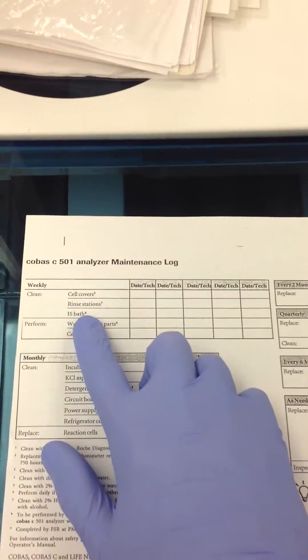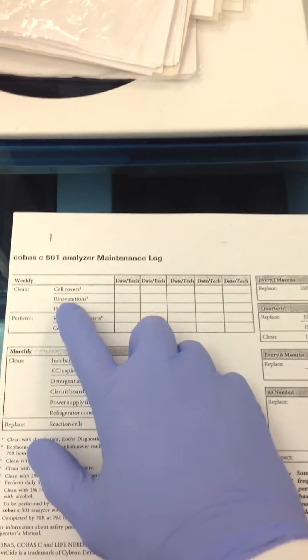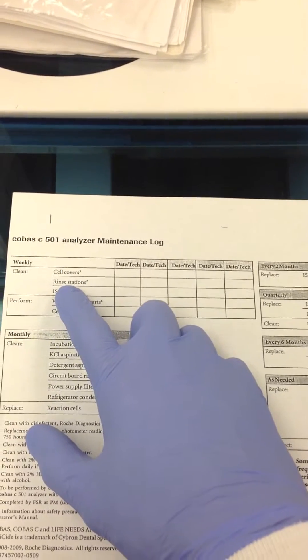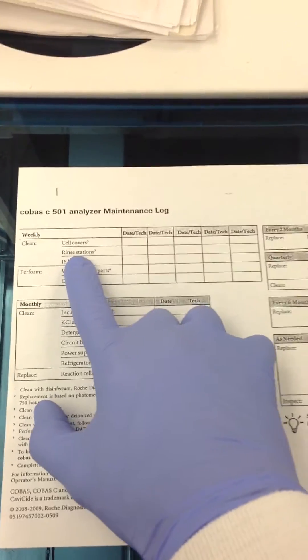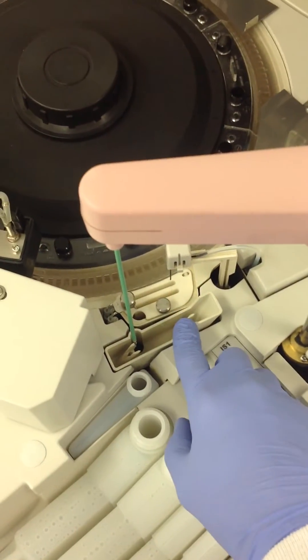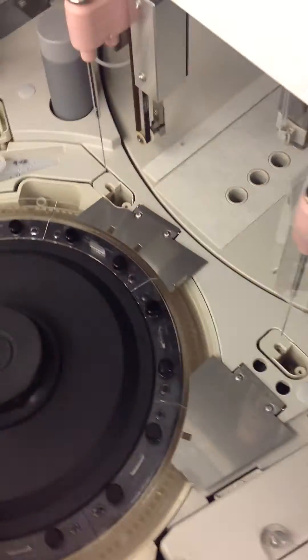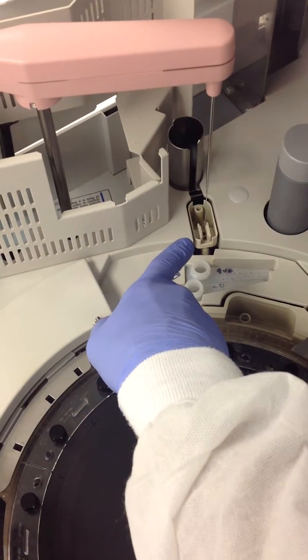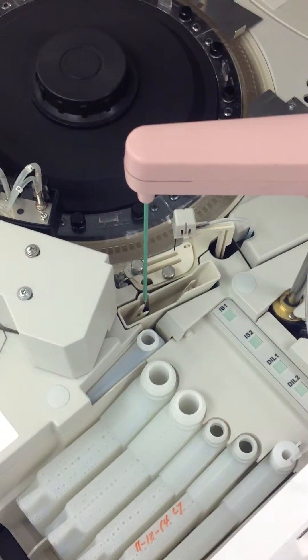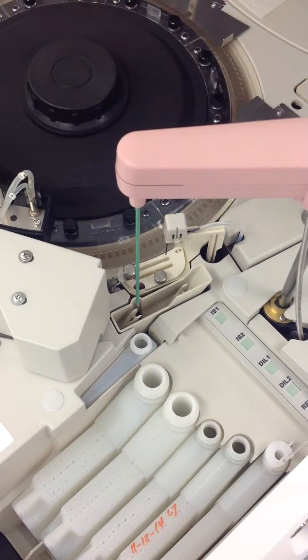The next step is going to be your rinse stations, and that's what you're going to use the Ecoturge and the DI water for. We have those little squeeze bottles, but we also have syringes so you can measure out the 50 mLs. You're going to clean the ISE rinse station, the probe rinse station, and then the sample probe rinse station — 50 mLs of 2% Ecoturge followed by 50 mLs of deionized water.